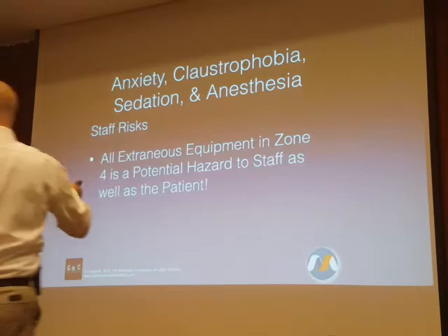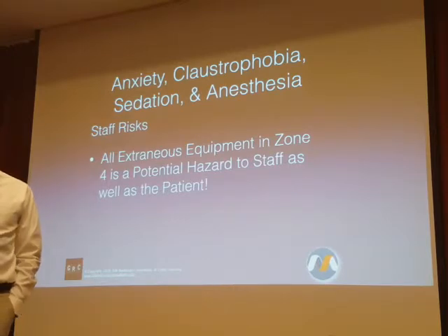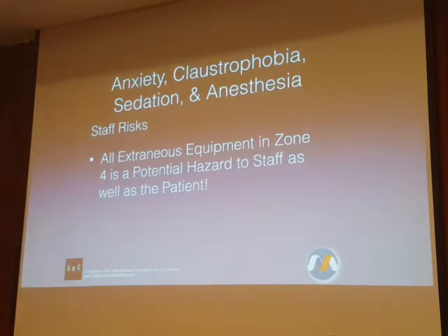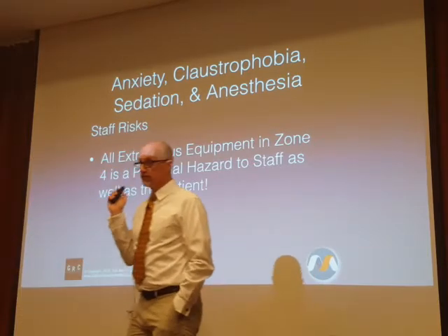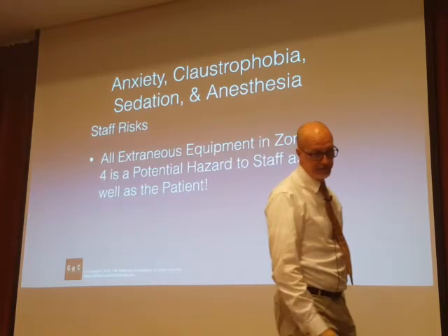I don't have them in the slide presentation, but I can show you adverse event reports to the FDA of anesthesia equipment inappropriate to the MR environment that is brought in and winds up harming the anesthesiologist themselves, or the anesthesia nurse, or the radiographer, or a physician in the room. It has happened repeatedly. So this is not just a question of patient safety, this is also a question of safety for your staff.